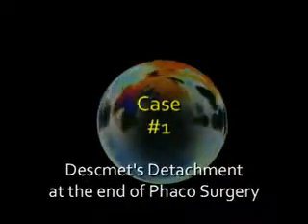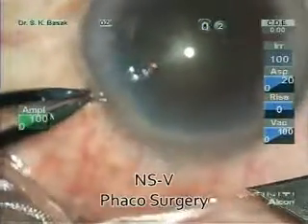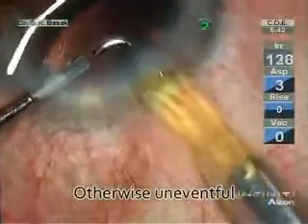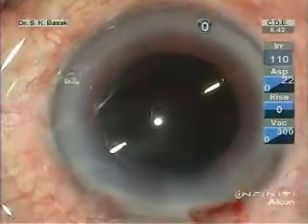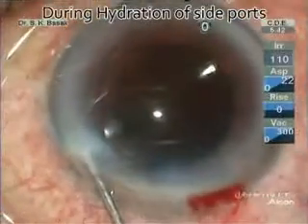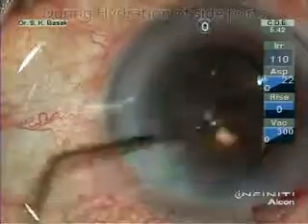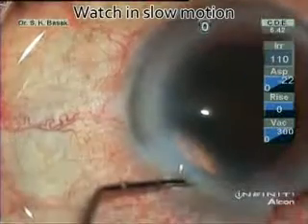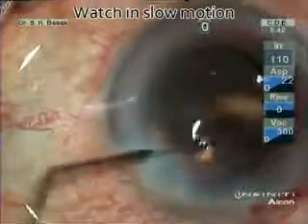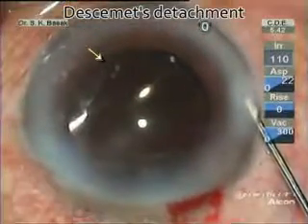Case scenario 1. Descemet detachment at the end of phacosurgery. Otherwise an uneventful phacosurgery. DM detachment happened at the end during hydration of the left hand side port. Watch it again in slow motion. Movement of detached DM noticed.